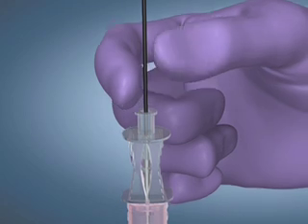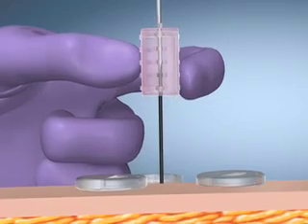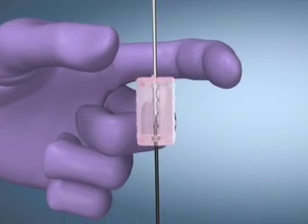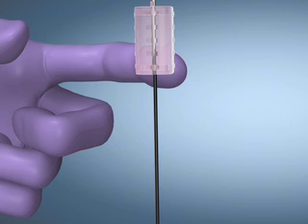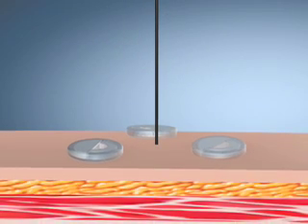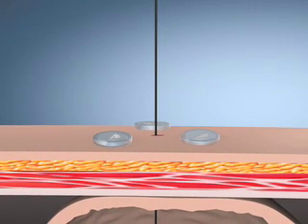Remove the safety introducer needle, keeping the J guide wire in place, and activate the safety collar. Slide the introducer needle safety collar down to the needle shaft while removing the safety introducer needle to prevent inadvertent needle stick. Use the number 11 safety scalpel blade to create a small skin incision that extends alongside the guide wire, downward through the subcutaneous tissue and the fascia of the abdominal musculature.